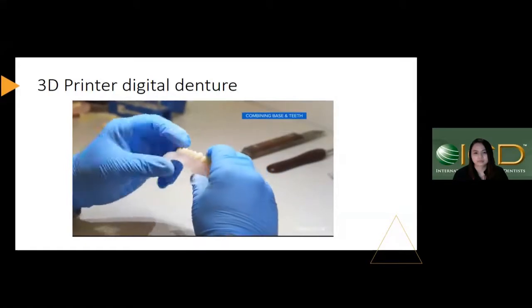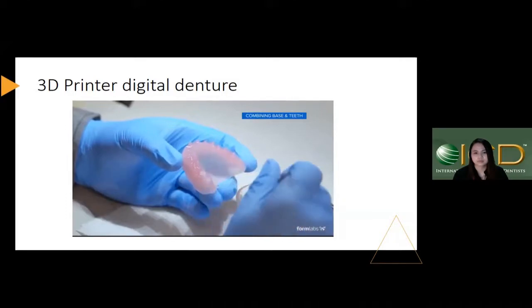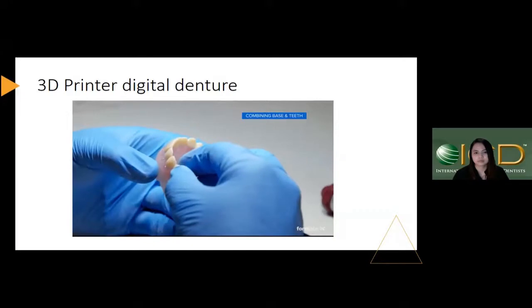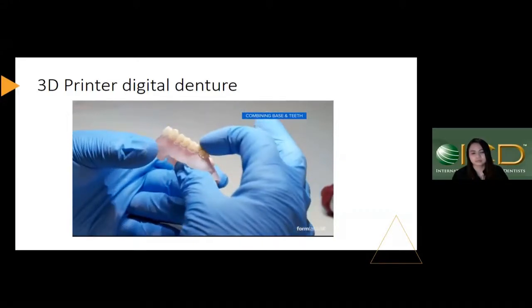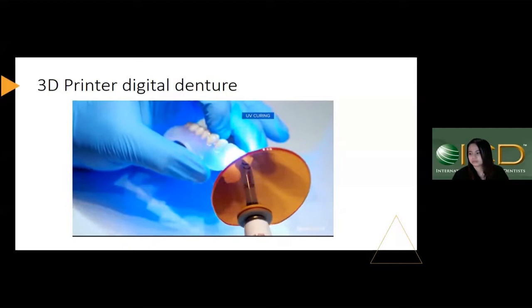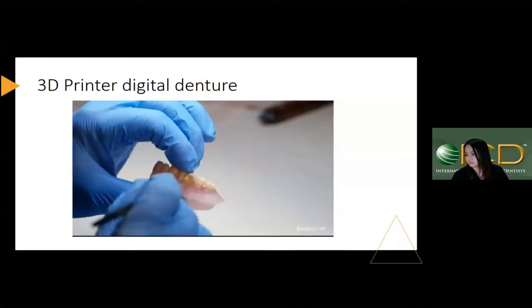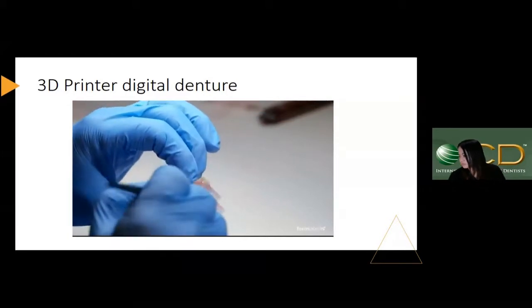Once you remove the supports and washed your parts, take a small cup of denture base resin and wet the sockets with a brush. Place the teeth into the sockets starting from the posterior. Press the base and teeth together with one hand, and with the other hand, use a handheld UV cure light to tack the parts together. Continue repeating this process and move across the arch and forward until complete. You can also add denture-based resin to the interproximals or remove excess resin if needed.